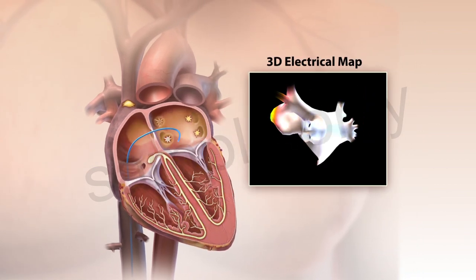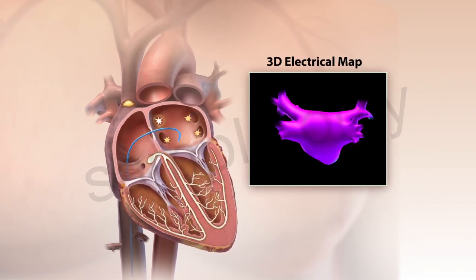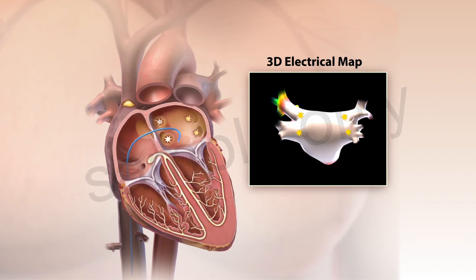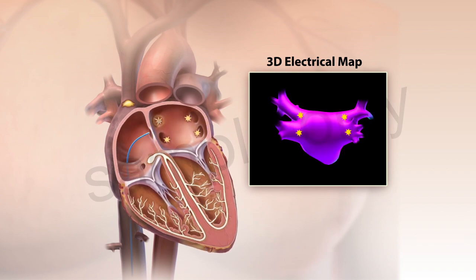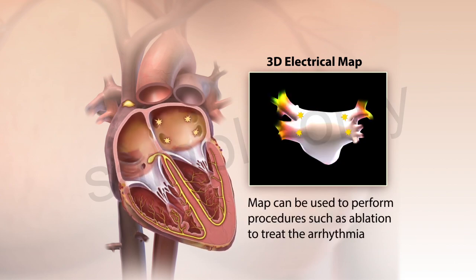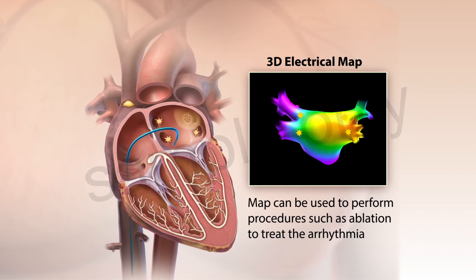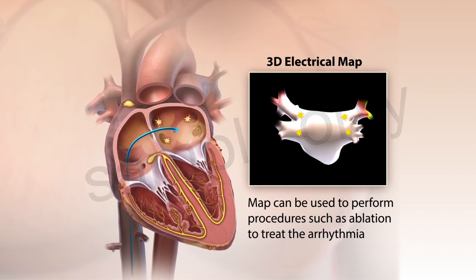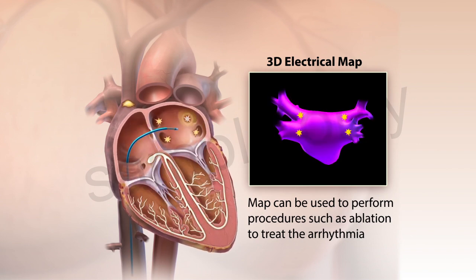This animation shows the electrical mapping of the left atrium and the origins of electrical signals causing atrial fibrillation. The physician can use this mapping to perform procedures such as ablation to treat the arrhythmia.